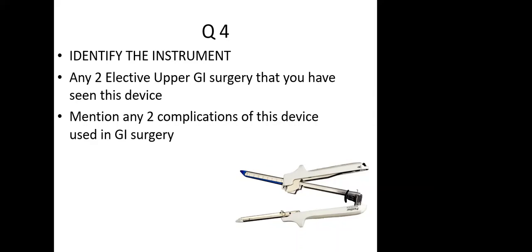How do you sterilize this instrument, sir? Sir, it is sterilized by autoclaving. Okay, this is now a trick question. Whenever you talk about sterilization, these are usually single sterile devices, usually devices of single use. So please remember that. The cartridge, sir, or the whole of the stapler, sir?